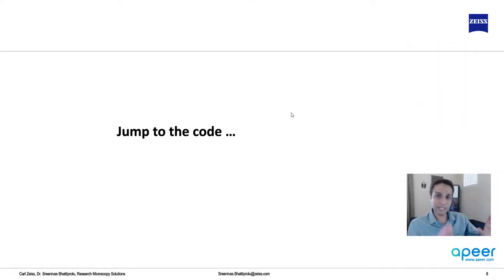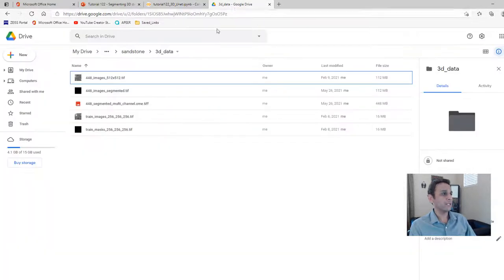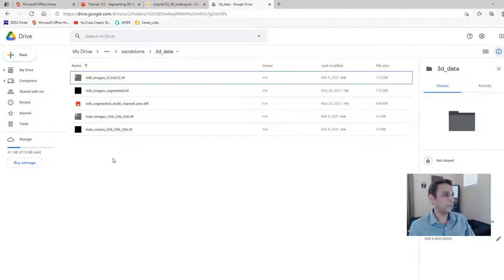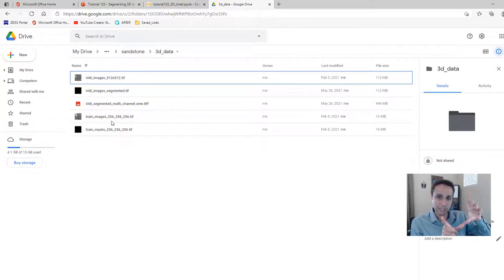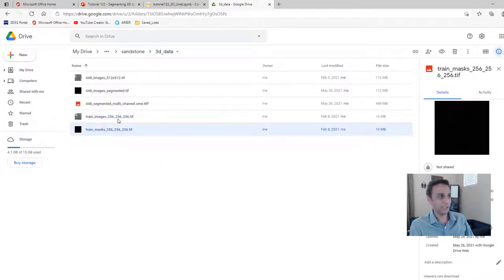Let's jump into the code. The data is organized as a single tiff stack of 256×256×256 for training images and another of the same size for training masks. There's also a larger test image stack of 448 images each 512×512 that we'll use later. The training images are 256 slices in Z and 256×256 in X and Y, and the masks match exactly.